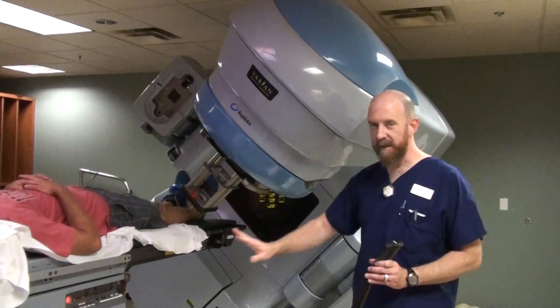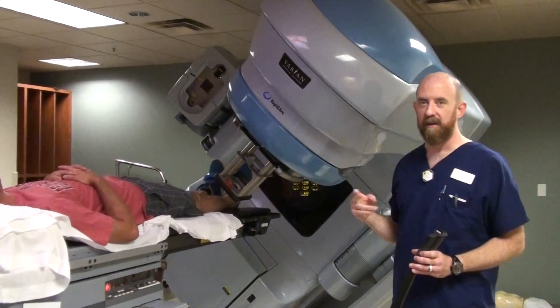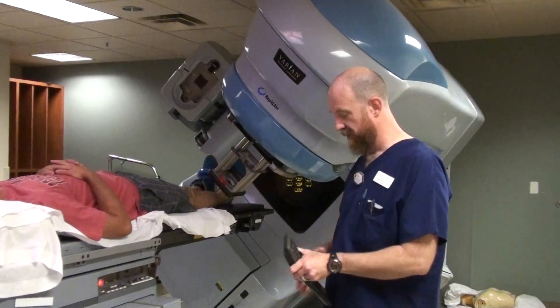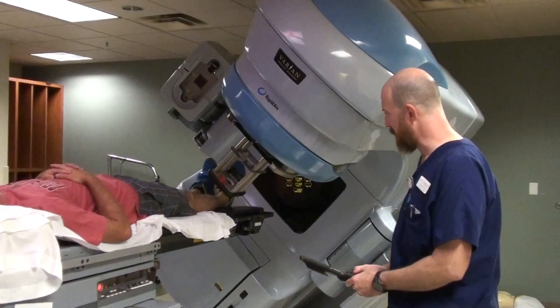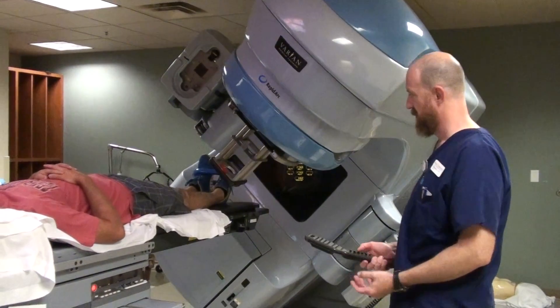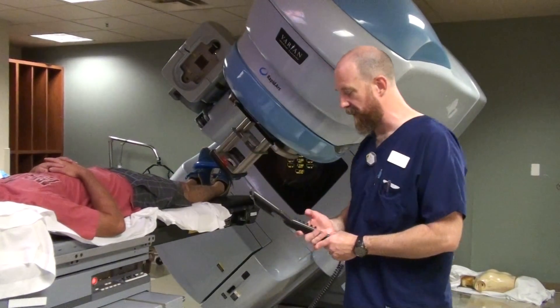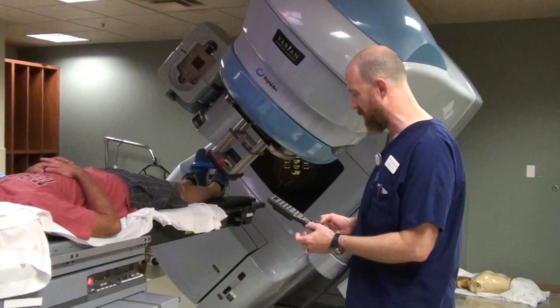So if you have the table straight with a gantry angle, you've got one aspect that's not as easy. You're going to have to actually stair step up to the gantry. In this case it's a 45 degree angle to show you exactly what we're talking about.